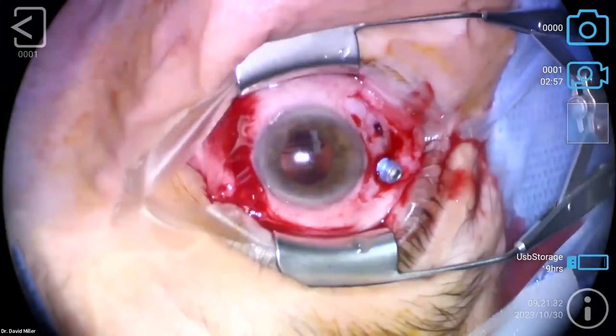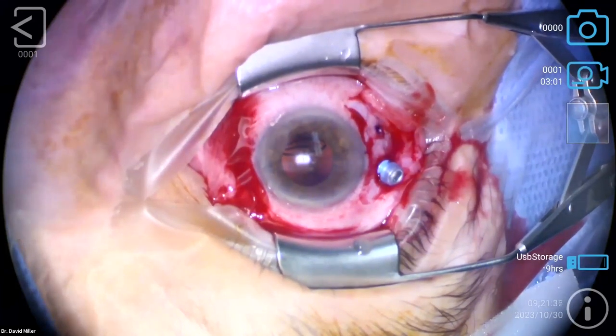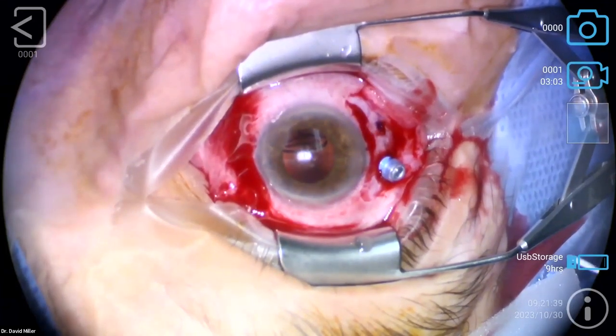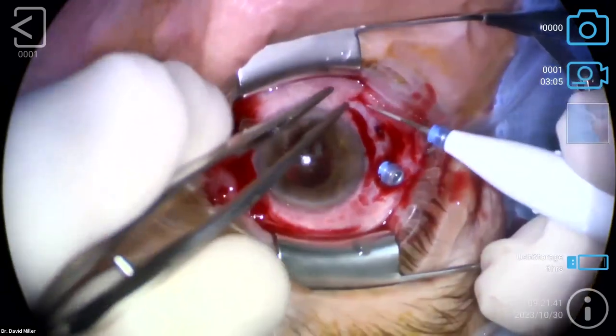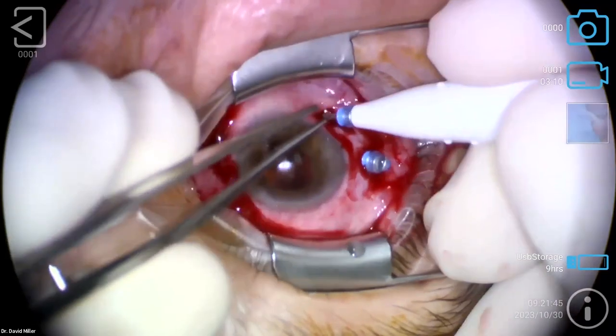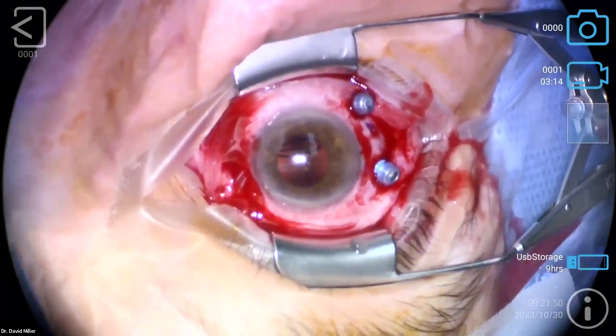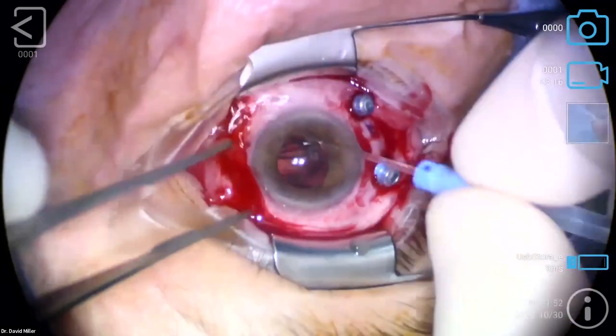You got the infusion cannula? Let's stick that in while we're dancing around. No, I mean just the cannula. Yep, and next one. So here we go. And this, I just want to be away from these two so it's not in the way. And that one I kind of tunnel in, as you probably saw. Tunnel meaning putting in obliquely all the way through.